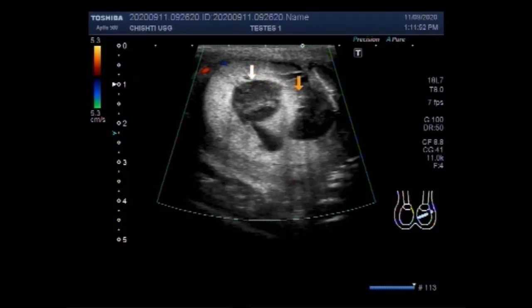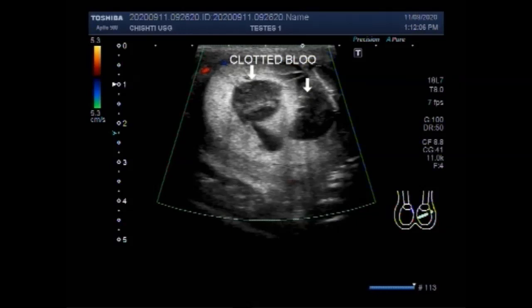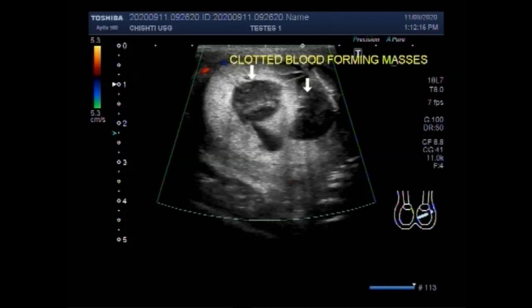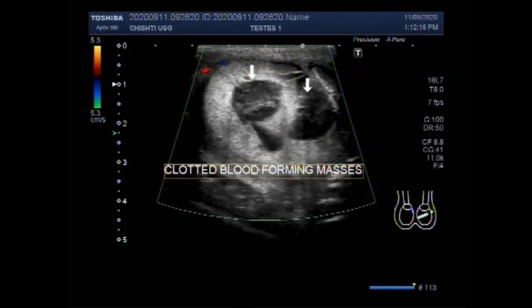Scrotal ultrasound is performed with the patient lying in the supine position and with the scrotum supported by a towel placed between the thighs. You can see the multiple hematomas — these are clotted blood debris and fluid. The use of a 7 to 14 megahertz high frequency linear array transducer is preferred.